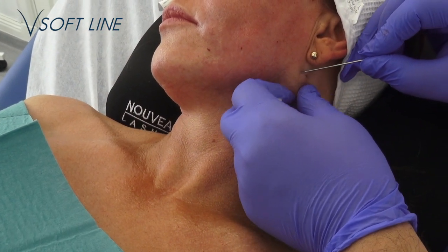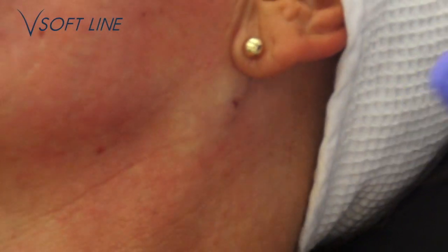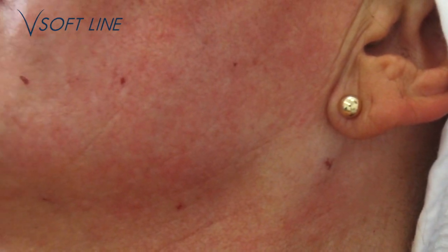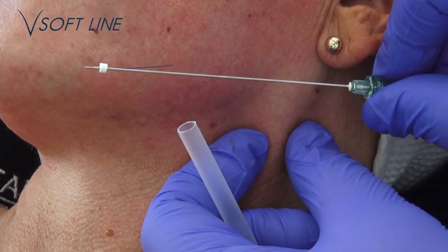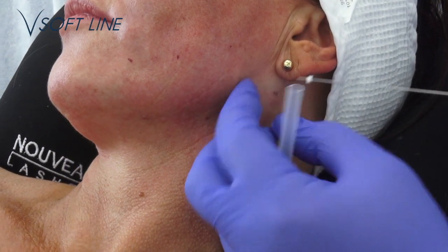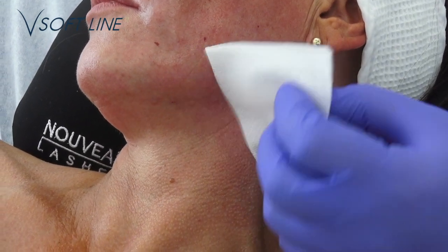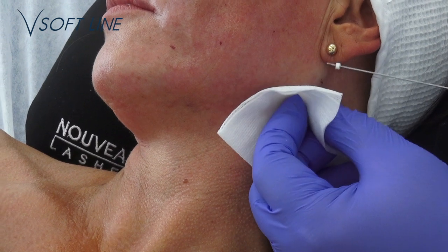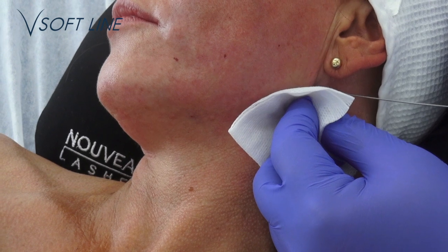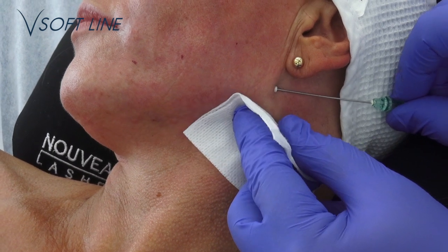So now we make another entry hole in the skin here. Entry point in the skin. There you go. Same thing here. Measure from the point of entry to the given destination point. Find the entry hole. Use your free hand to tighten the skin strongly when entering, then tilting the cannula to a less steep angle to see that the needle is properly positioned.